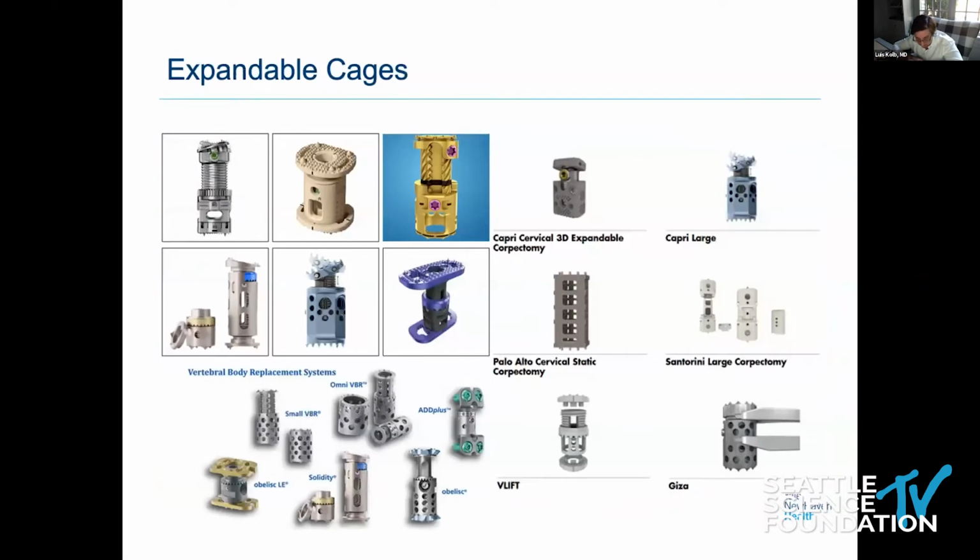We had some great demonstrations in the lab today when it came to expandable cages, but they really are very powerful when it comes to reducing kyphotic deformities, particularly in metastatic disease. Placement, either anterior lateral or posterior lateral, really varies, and without any favorite, they can provide a significant expansion and significant reduction of these deformities. Now with advancements in these cages, with modeled pieces and adjustments to the endplate attachments, even more normal alignment can be introduced as these cages are being deployed.